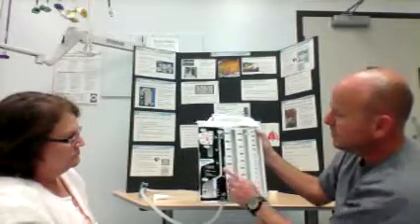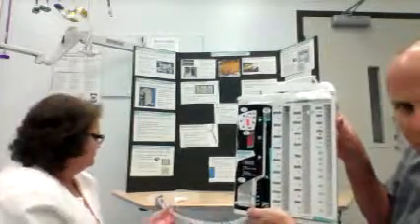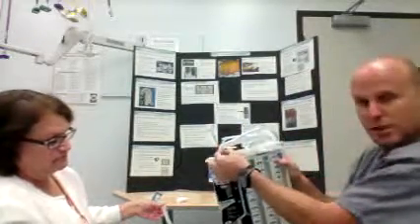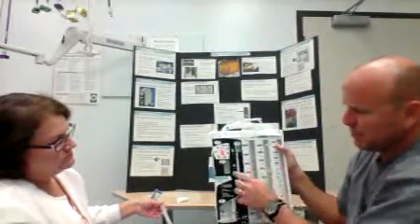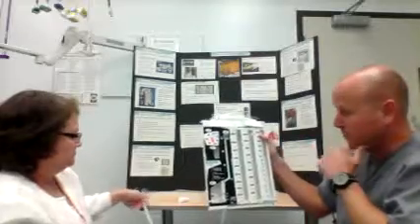Okay? Let's see. This part here, this orange, this spot here that says E, there's an orange bellows in there. If you're not just going to have it on water seal and the doctor orders suction, this is where your suction tubing hooks to. You would hook it to wall suction or portable suction. Turn your suction up to at least 80. And in this particular model, when the suction is working, this orange piece right here will come out and you'll see it. So that's how you know that your suction is actually working on this particular model.